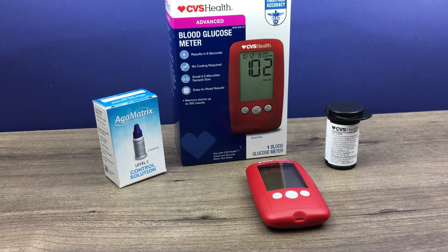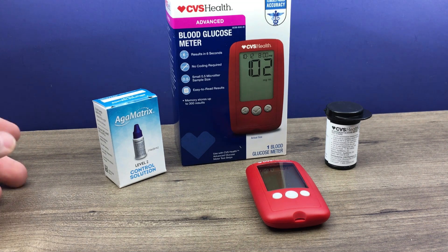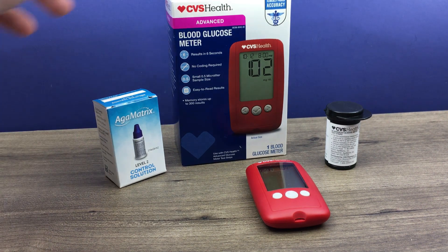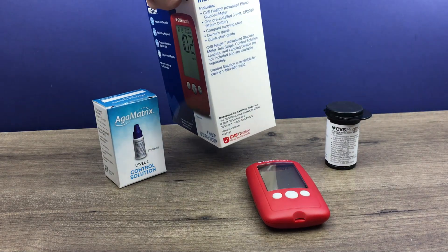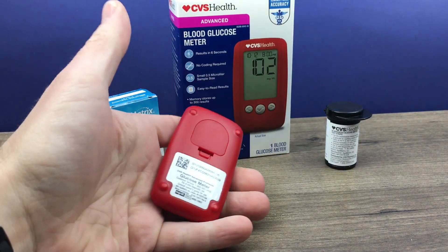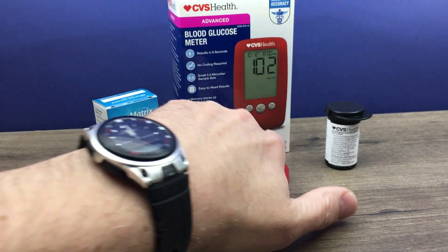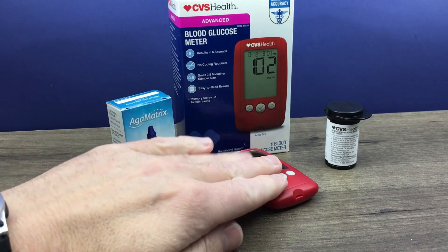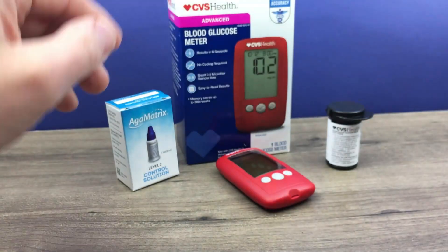Okay, let's perform a control solution test. Now obviously to complete the test you'll need the control solution, which CVS will send to you for free. There's a number on the side of the box — that same phone number is also on the bottom of the meter. You call them and about a week later you'll get this in the mail. So you need the control solution, the meter, and test strips.